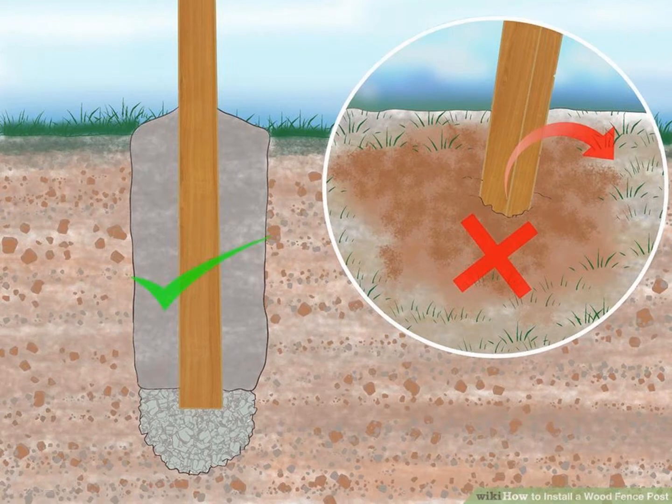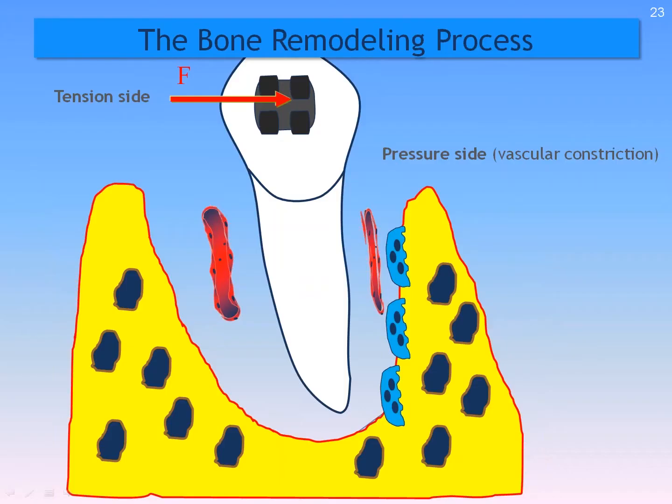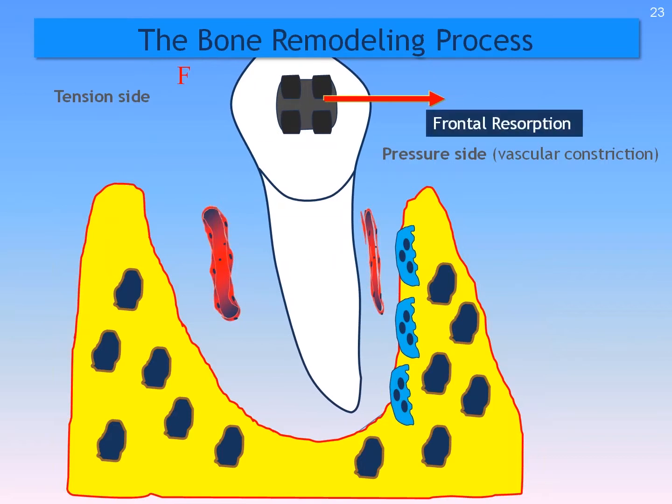So when we use accelerated tooth movements with clear aligner therapy, basically what we're doing is making a space around the bone or around the fence post where the ground now becomes, instead of concrete, more like quicksand. And that fence post can slide easily in that quicksand to a new position, and then the quicksand turns back into concrete. It hardens up again. That, in essence, is the regional acceleratory phenomenon, so that when you put pressure on the tooth and it moves sideways, there's space for it to do it because it's mushy and it's soft, and the tooth is able to move that way.